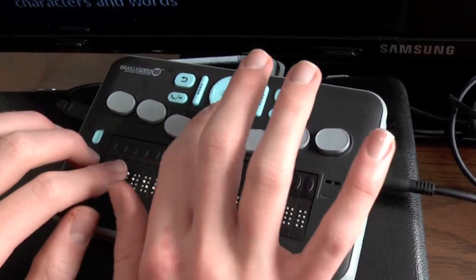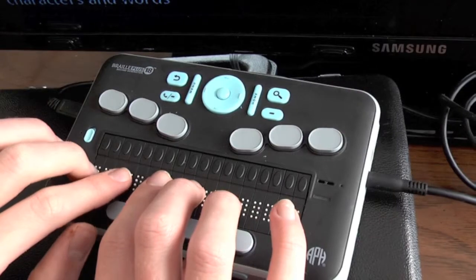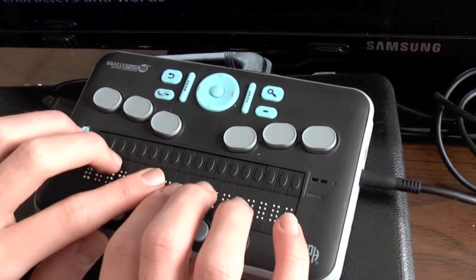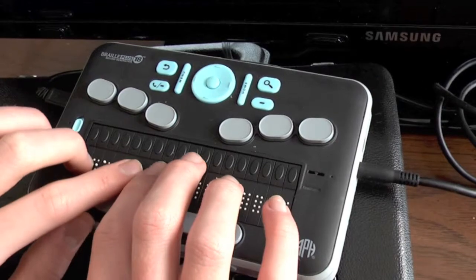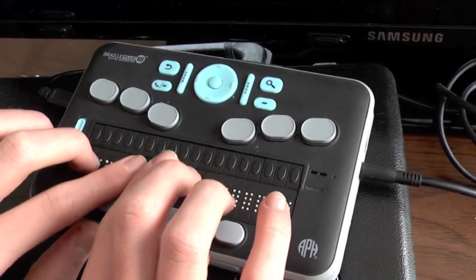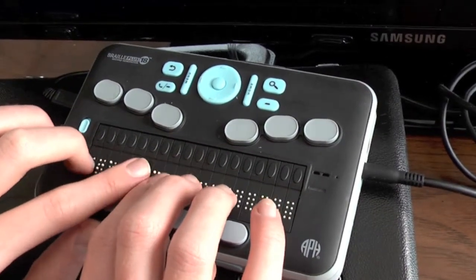If I down arrow, Edit 9:32 p.m. Computer Braille required. This is where we set the time. Now I am going to delete what's in this field. Again, I'm going to find the cell that is blank directly to the right of the last character, which in this case is the M of PM. Find the oval-shaped cursor routing button directly above it. Press that. 9:32 p.m. I stop the speech with the Shift key again.